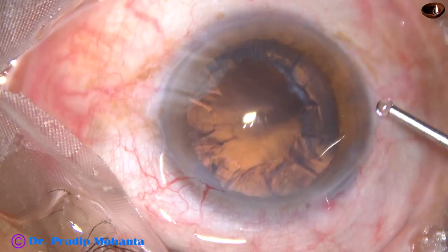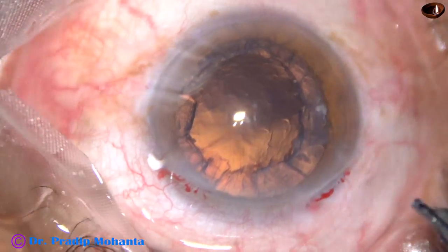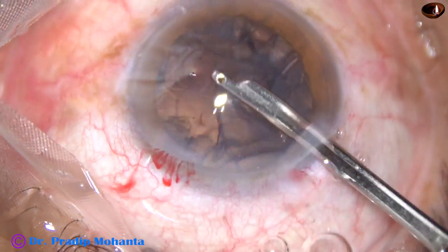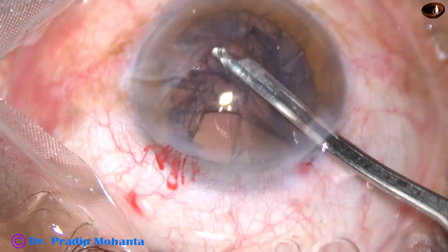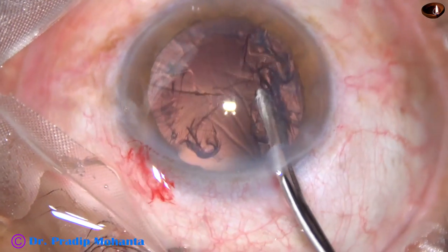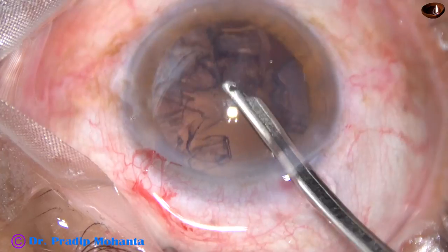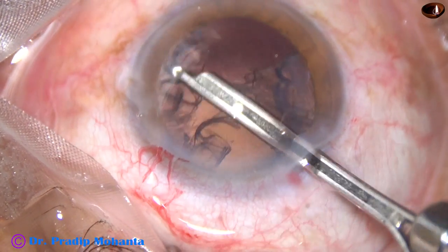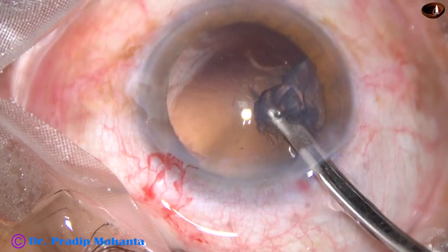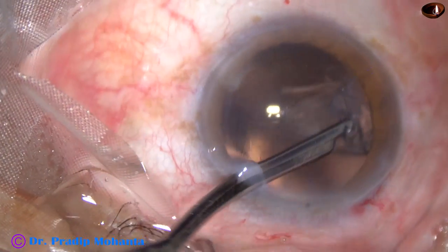Visco — 2% HPMC — is injected again. This maintains the anterior chamber when a Simcoe is used through the main wound. If we don't use this, the anterior chamber tends to be shallow. But if visco is injected, the anterior chamber remains stable for quite some time. Care is taken to lift off the anterior leaf of the main wound, which causes less leakage of fluid through the main wound. So most of the cortex has been removed, and now the cortex at 10 o'clock is being removed through the side port at 2 o'clock.